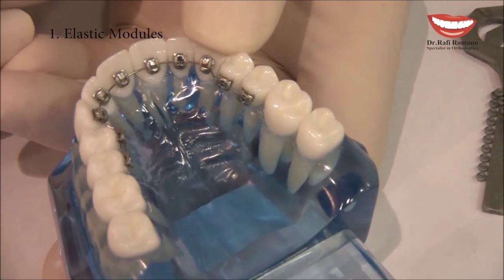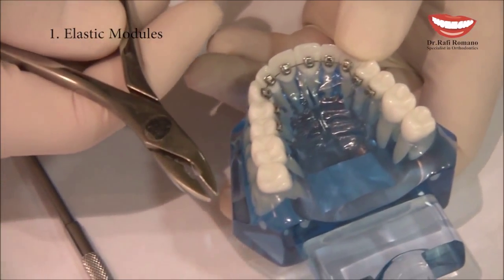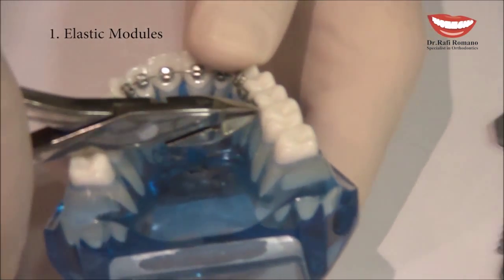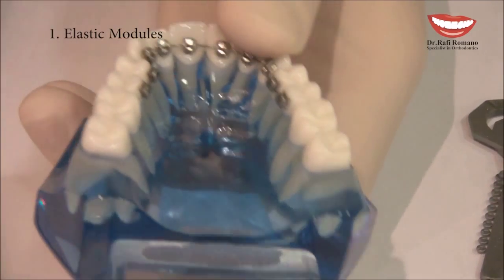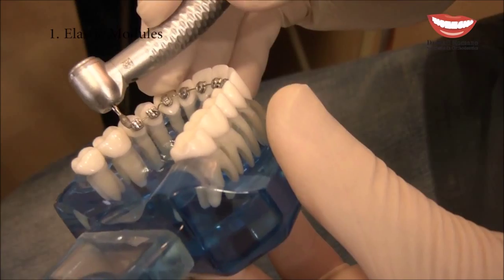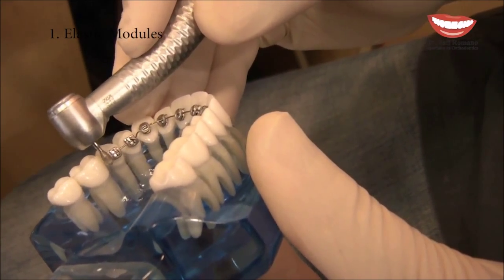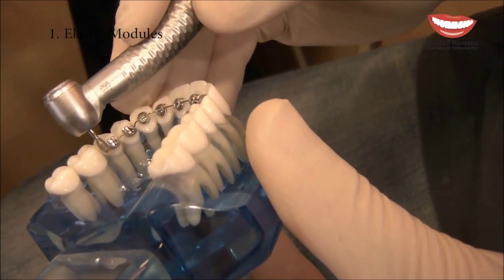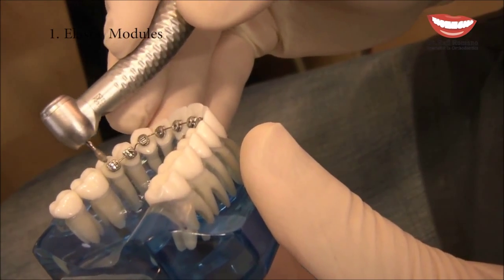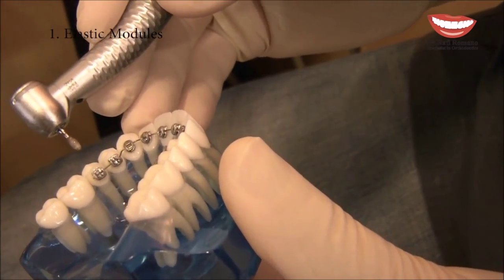To address the wire poking the tongue, we can either use a regular ligature cutter, or use a diamond bur — usually a flame shape — to slowly and gently cut the excess of the wire. If needed, replace the elastic here because sometimes the elastic is torn by the bur.